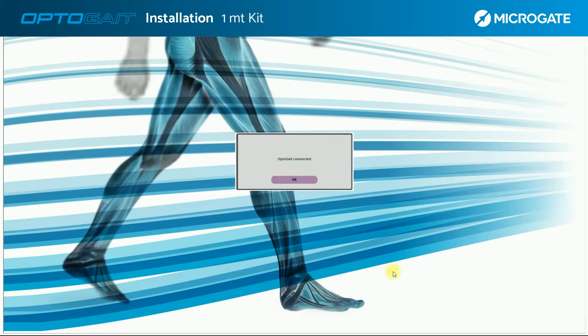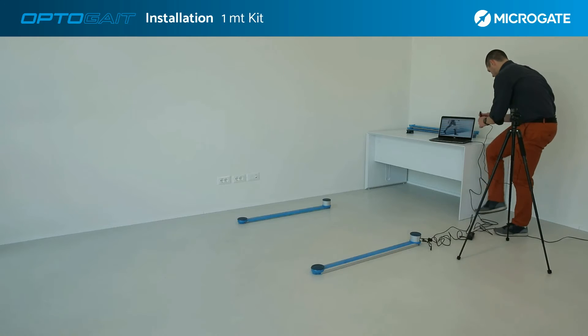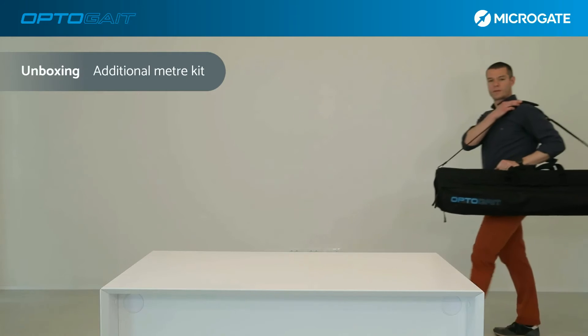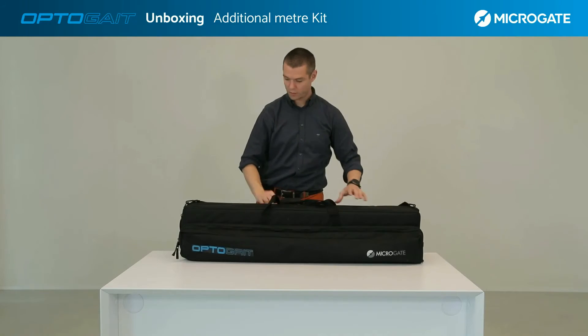Lastly, if you wish to combine a test with video analysis, you must connect the webcam previously fixed on the supplied tripod or on another support of your choice. As we have seen, the OptoGate kit is an expandable and modular system, scalable from 2 meters up to 100 meters.